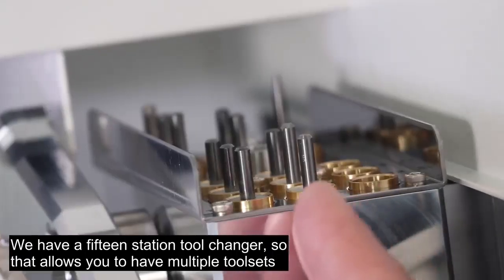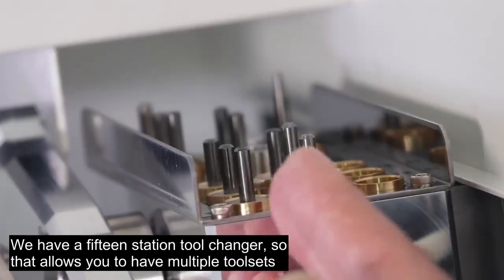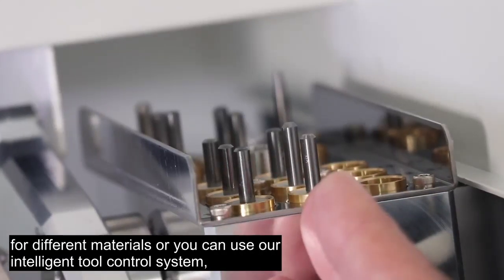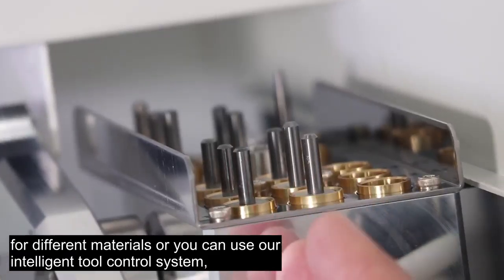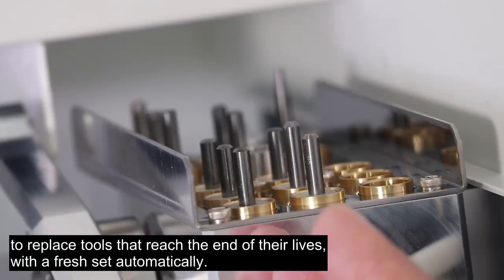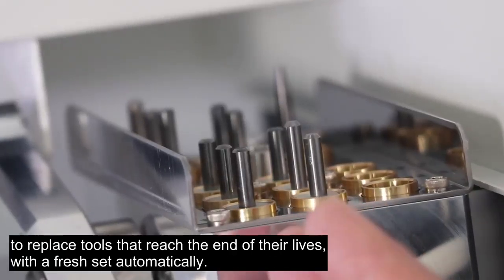We have a 15-station tool changer, so that allows you to have multiple tool sets for different materials. Or you can use our intelligent tool control system to replace tools that reach the end of their life with a fresh set automatically.